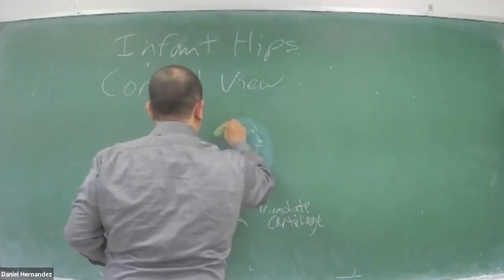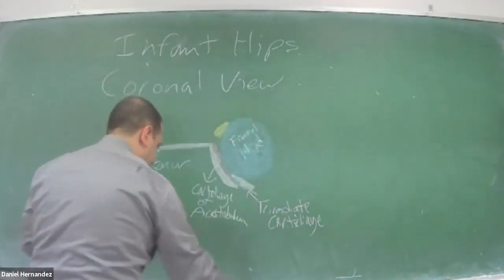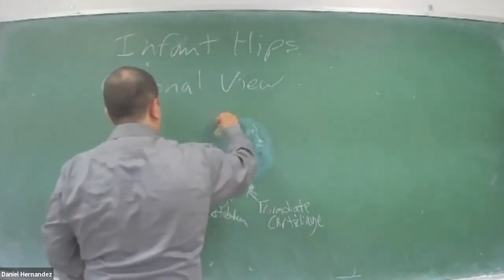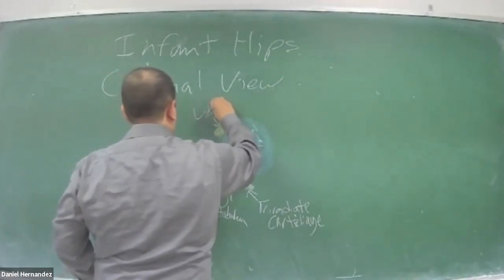Here, this is more hyperechoic. You have your labrum. That's another landmark that the doctors will like to see when you're doing the exam.